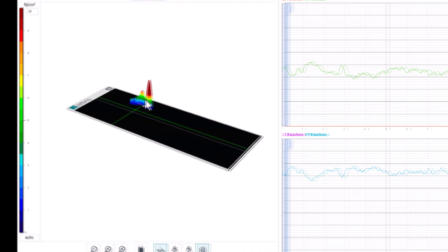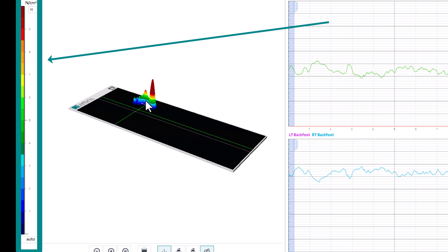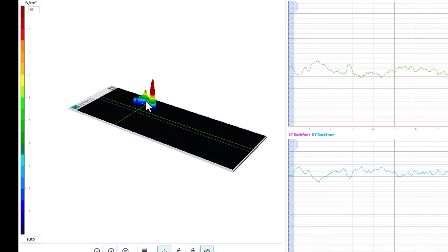On the left side is the pressure scale. By default, the fixed maximum pressure value is used for the pressure scale. This value can be set under Measurement Settings in the Measurement tab.